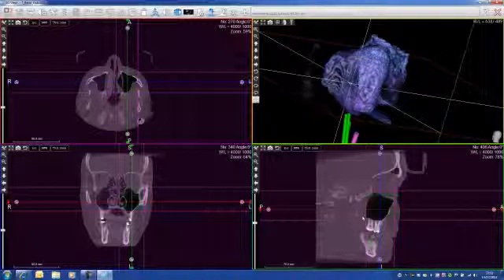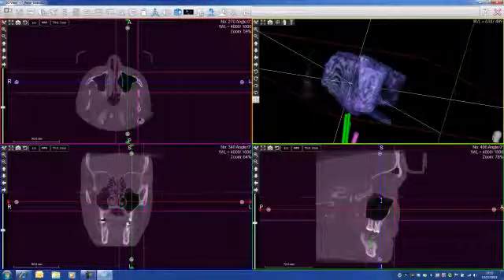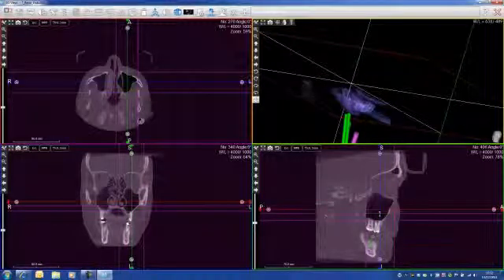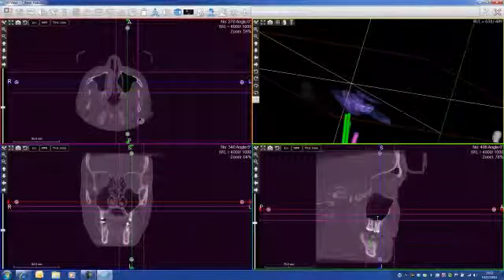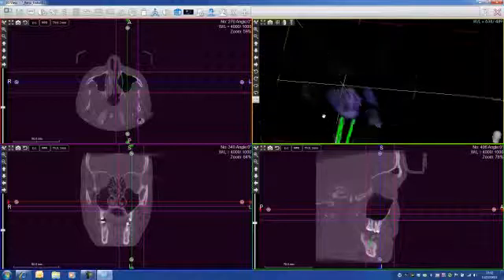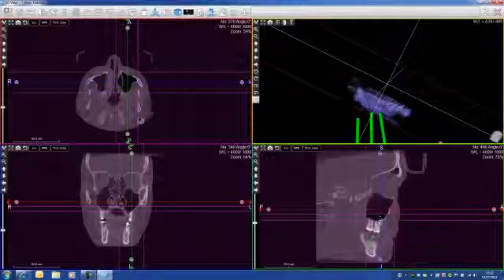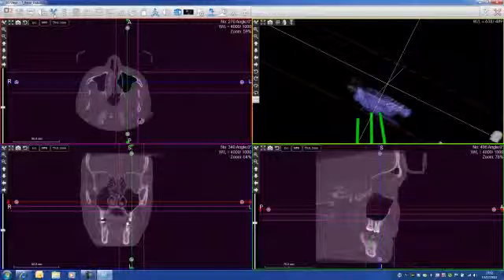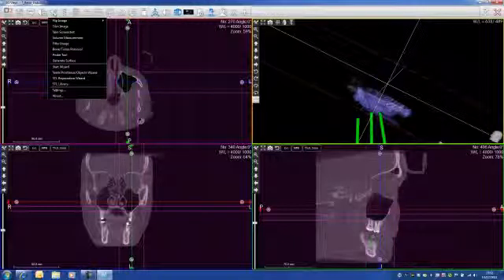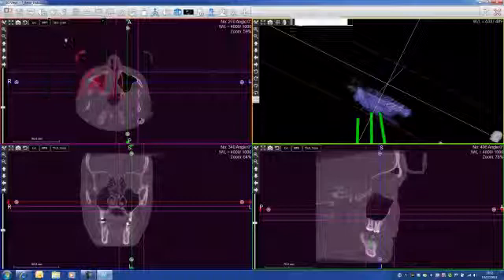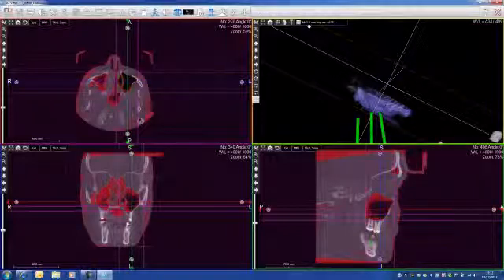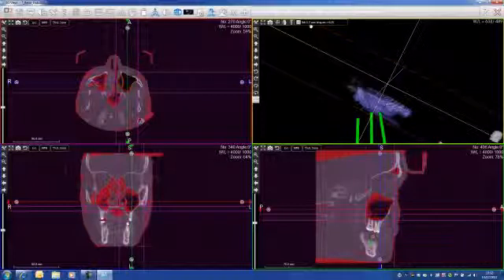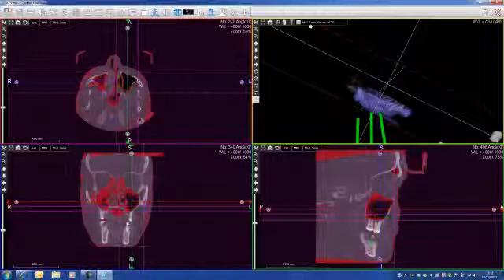Now, let's say that I want to actually inject the biomaterial on this surface — this is how much biomaterial I need, this little surface here. So what I can do is calculate how much biomaterial I need for this specific surgery. I go into these tools and select volume measurement. It tells me that I need 3.3 cm³ — cubic centimeters — of biomaterial. I can calculate any volume that I want, just like that.